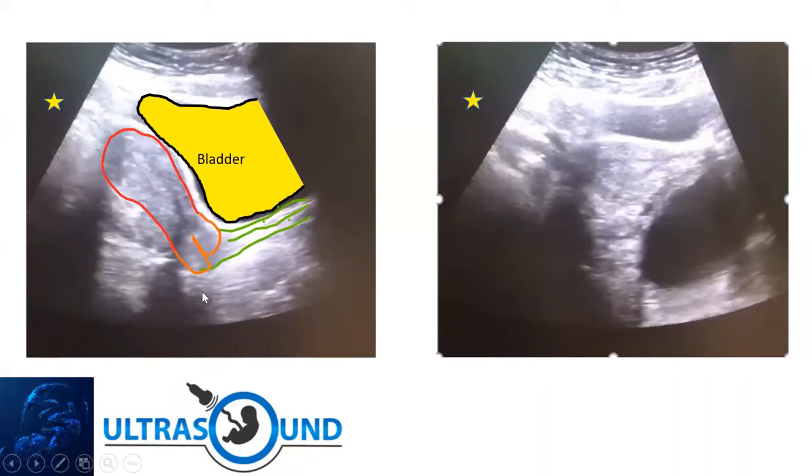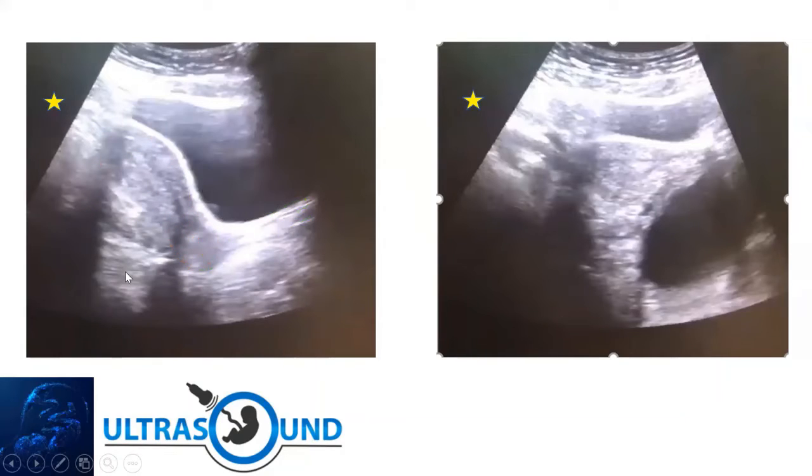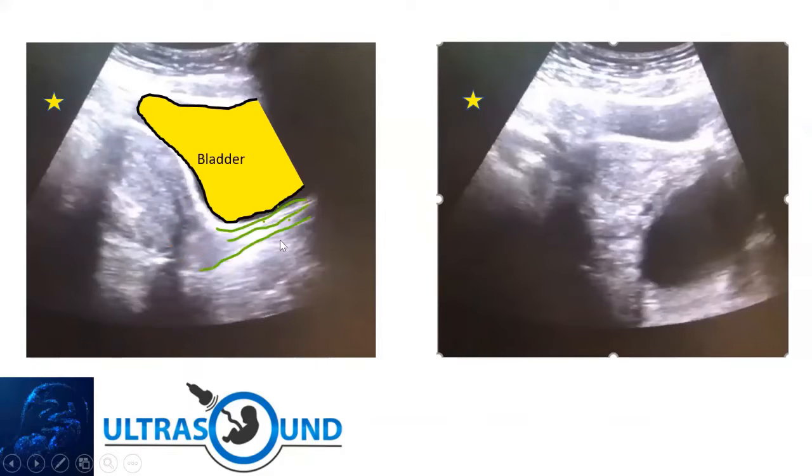And then subsequently, you will trace the endocervical canal, and this is the endometrial thickness. Then you will measure the ET. All right. And then this area is your pouch of Douglas. All right. So just now, I hope you can see better with this marker here.